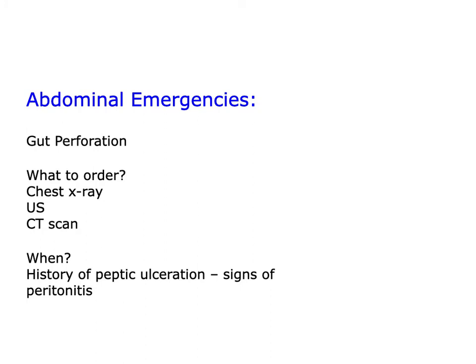Okay, let's look at another emergency. In this case, it is perforation alone in this chart. So when you suspect perforation, what are the things you have to request? The first thing is a chest X-ray. Chest X-ray, not abdominal X-ray. If you are suspecting perforation, chest X-ray.